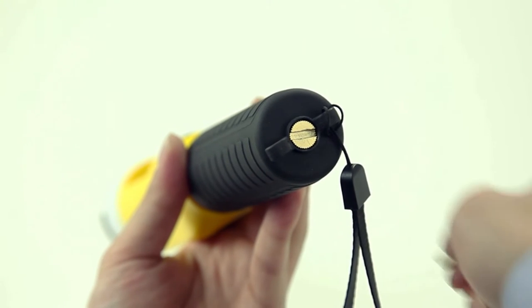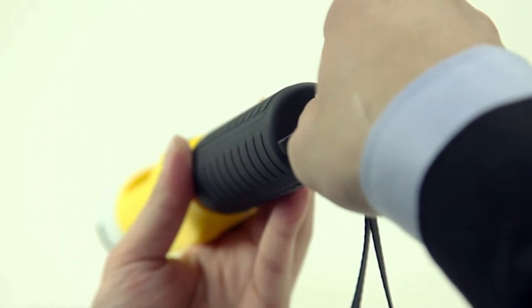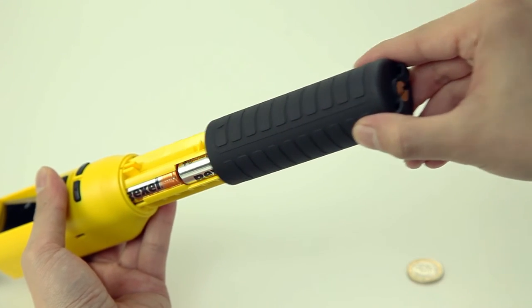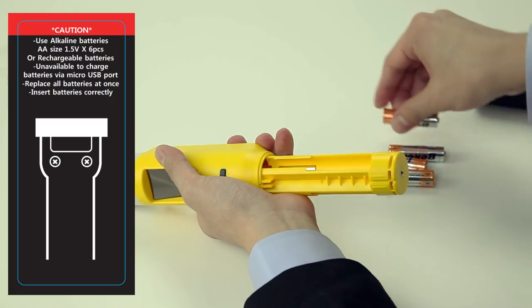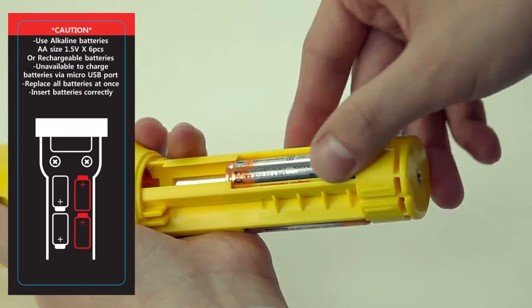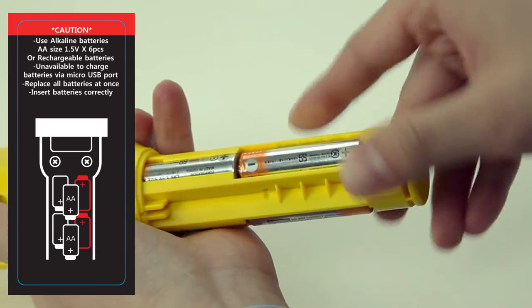When using the iBlow 10, open the battery cover at the bottom. This cover can be opened or closed with a coin and does not require a particular tool. After opening the cover, put in AA size alkaline batteries or rechargeable batteries and close the cover.